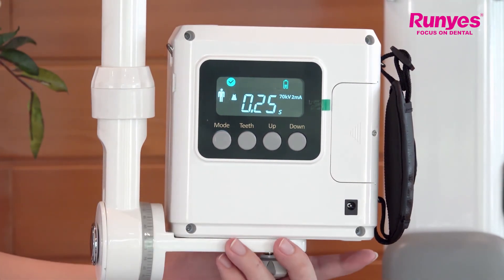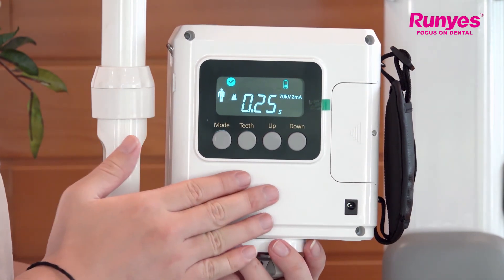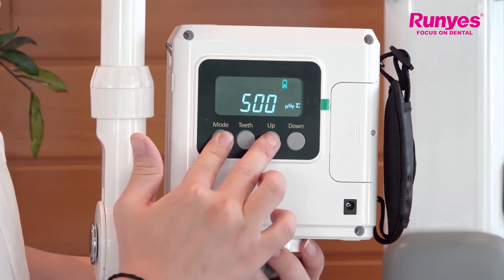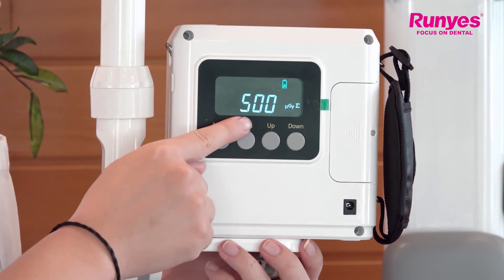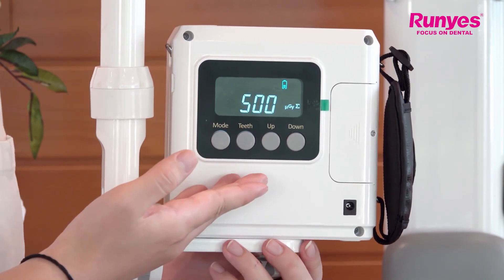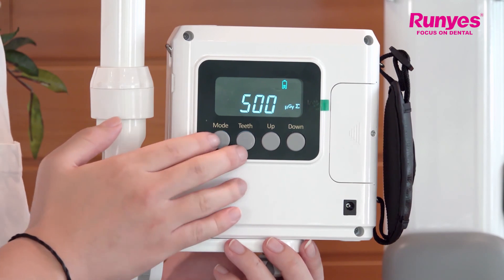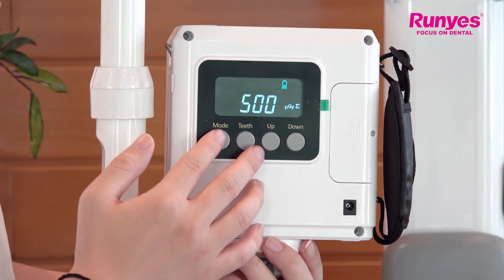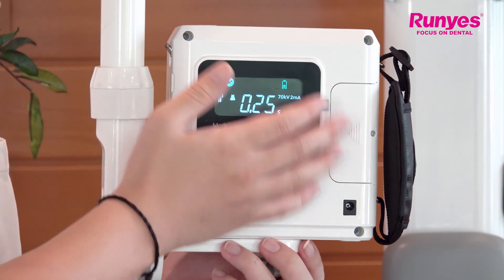Next, I will introduce another function — we can view the cumulative dose by pressing the mode key and then the up key. This shows the cumulative dose value of the device on the screen. From this dose number, we can know how many times the user has used it. Press the mode key and the up key again to cancel this viewing state.